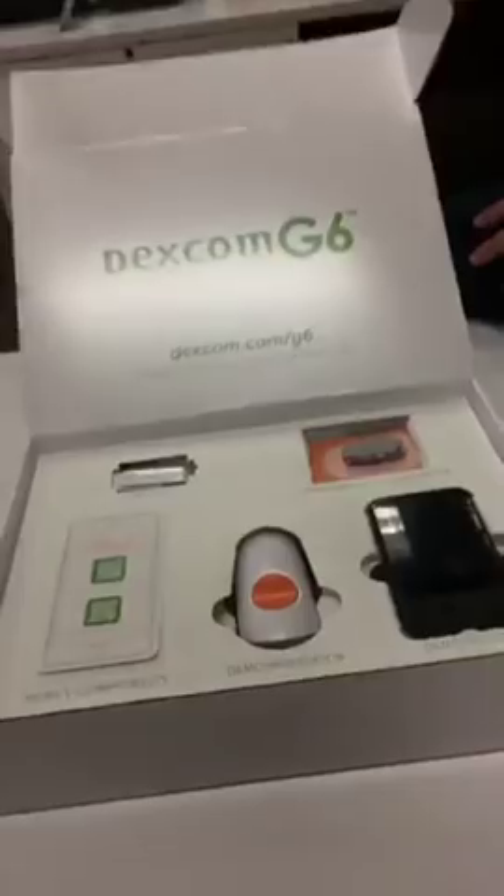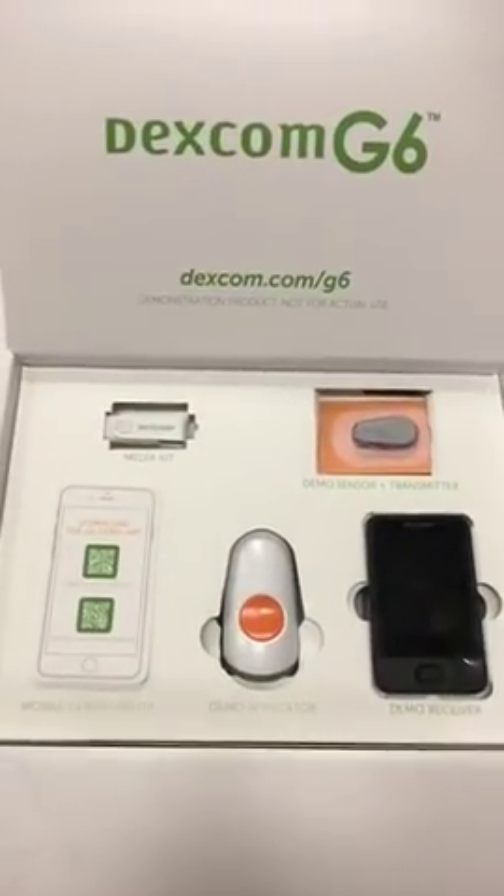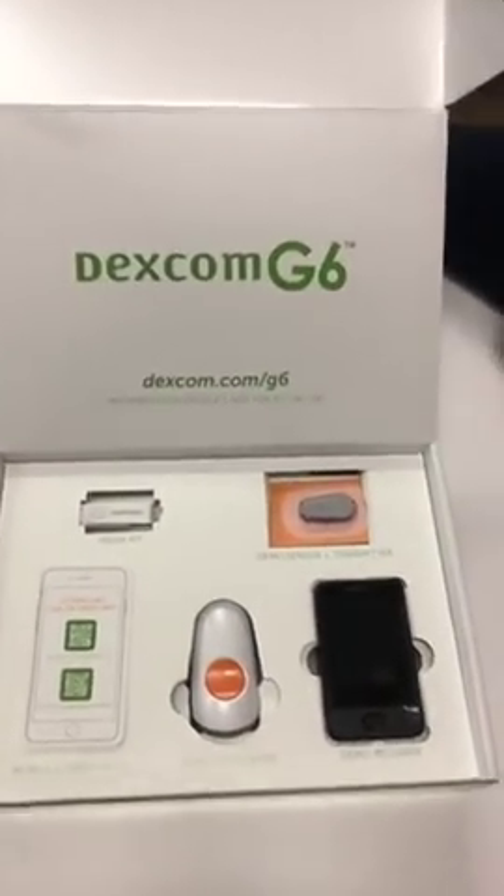This is Mary, our community partners and programs manager, and you're listening to Dana, communications manager. We are both Type 1 and we are both Dexcom users, so this is personally exciting as well as something we can share with all of you. Alright, what are we looking at, Mary?